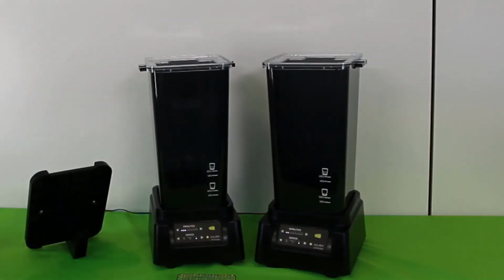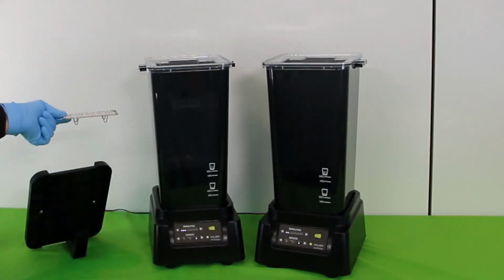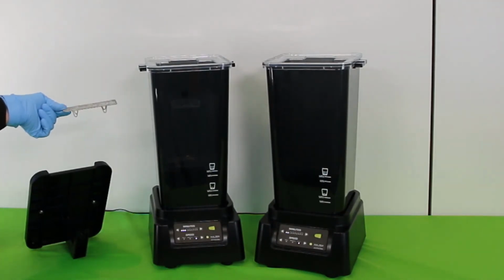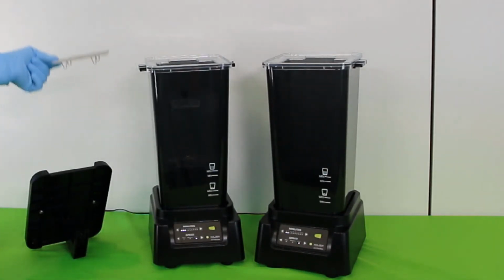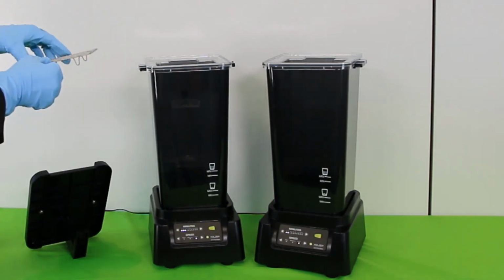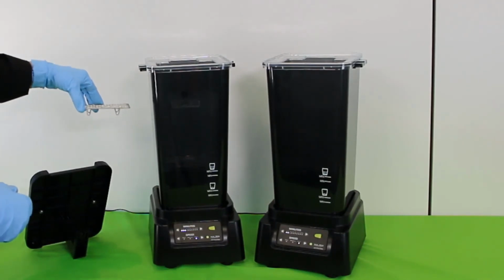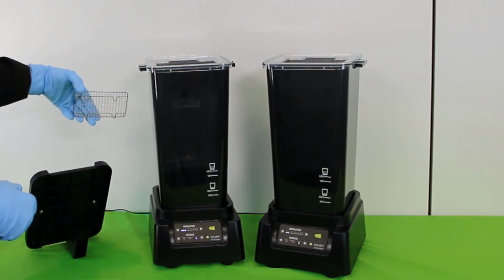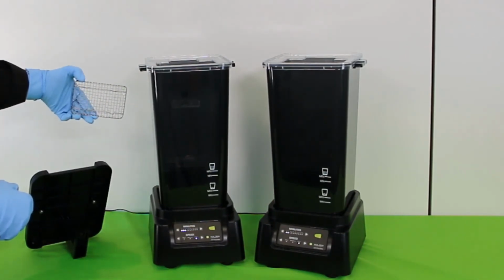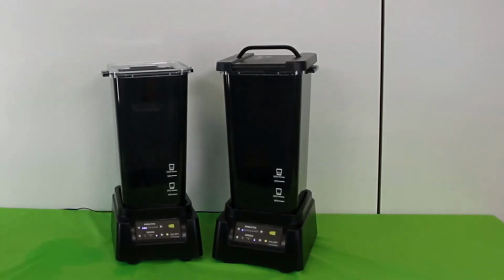Objects that are directly attached to the building platform and are not connected by support structures, such as dental models or gingiva masks, must be placed in the second cleaning bath on the part tray in the inner container. This is used on top of the magnetic stir bar in the inner container. Now the object can be placed on the grid and the cleaning process can be started.